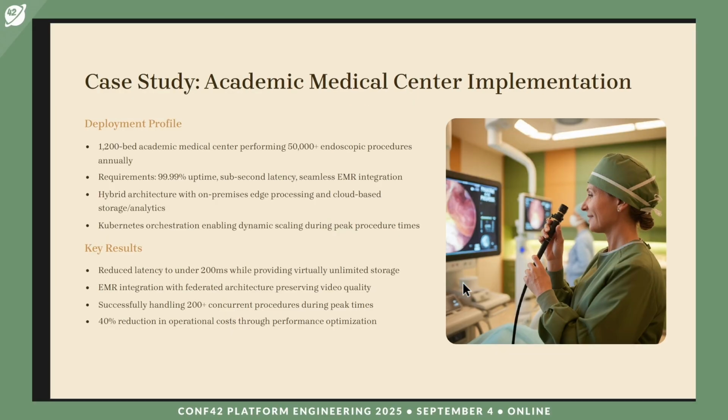Case study: academic medical center implementation. We had a deployment profile of a 1200 bed academic medical center performing 50,000 endoscopic procedures. Requirements: 99.99% uptime, sub-second latency, and Kubernetes orchestration enabling dynamic scaling during peak procedure times.